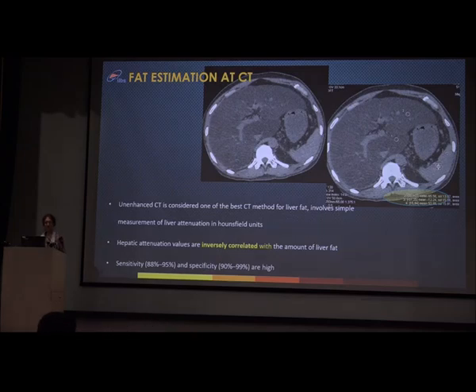Fibroscan. So the commonest one we're using here is a point of care Fibroscan. I'm going to talk to you about that as well, but let's start with other ones, and then I'll move on to ultrasound, which is the main topic. How are we assessing fat on ultrasound modalities? So a very favorite modality for me as well as for the surgeons is the fat estimation on CT.